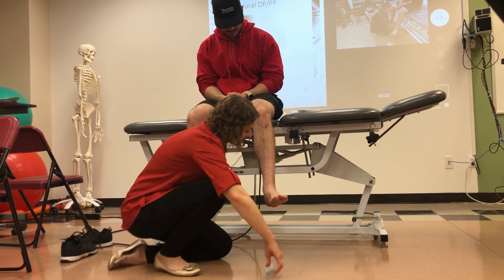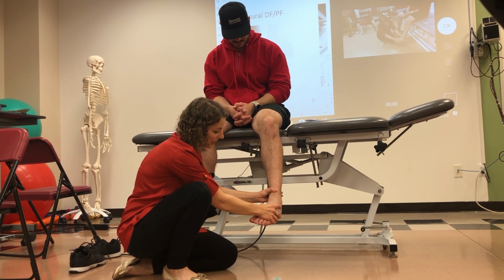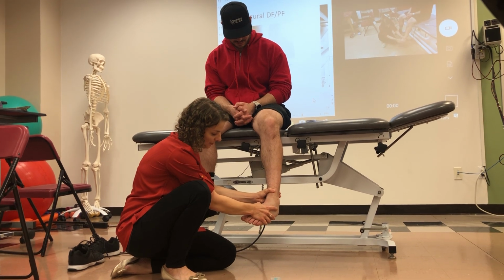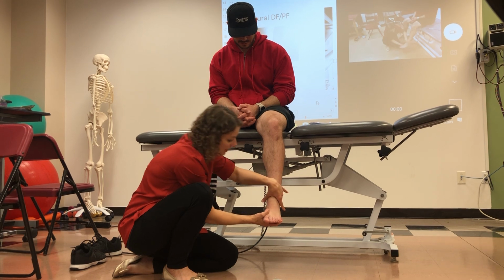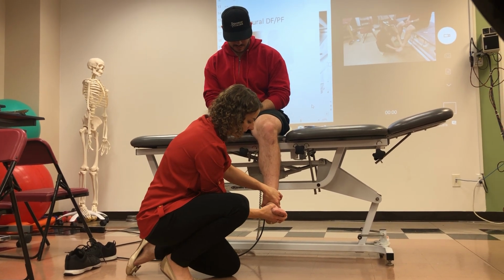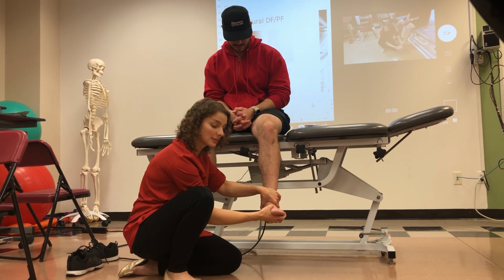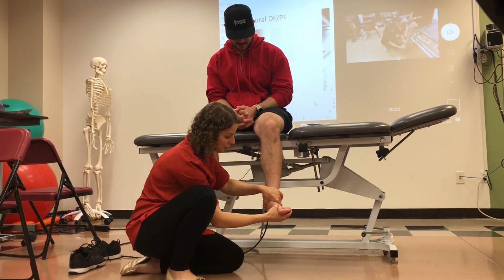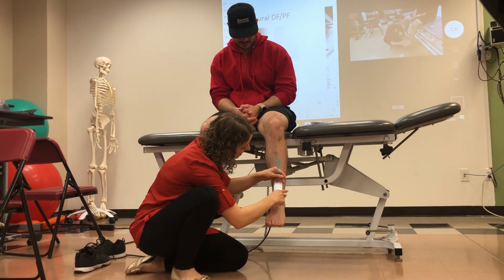So with inversion testing, you are going to be taking the patient into slight plantar flexion and inversion. So plantar flexion, inversion. Versus when you measure eversion, you're going to be coupling it with dorsiflexion. So dorsiflexion, eversion. And then you're lining it up with the same landmarks.